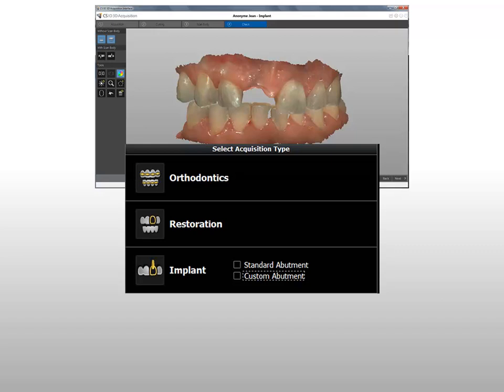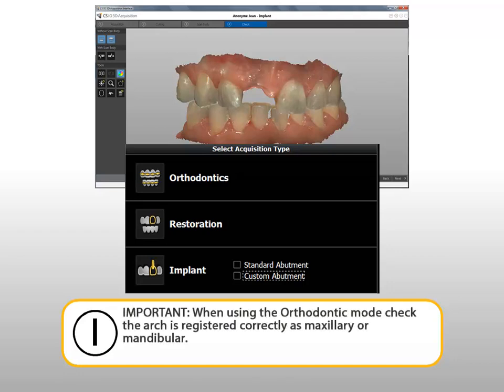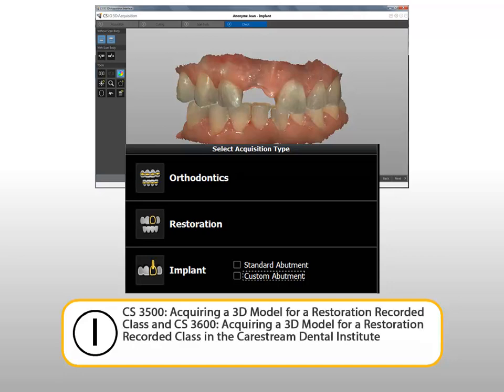When using the implant mode, select Standard Abutment. When using either the implant or restore mode, capture and identify a minimum of 7 teeth in the scan. When using the orthodontic mode, check that the arch is registered correctly as maxillary or mandibular.